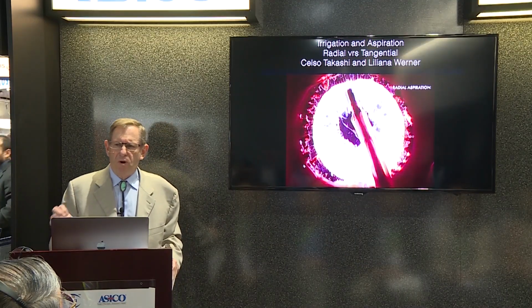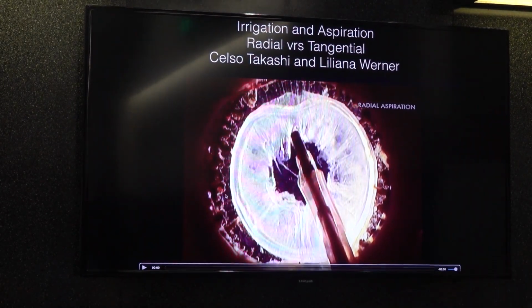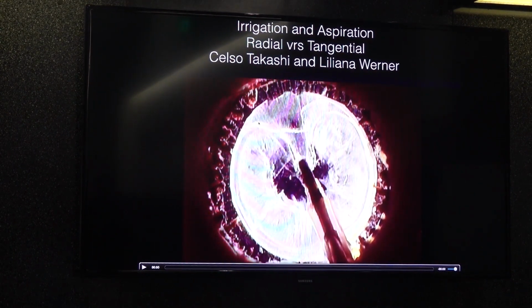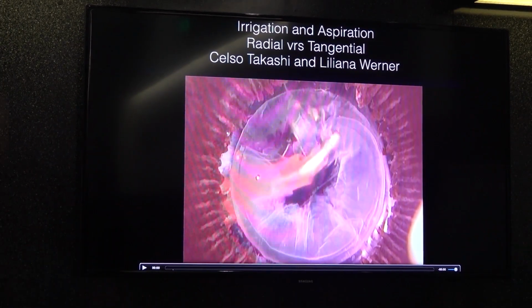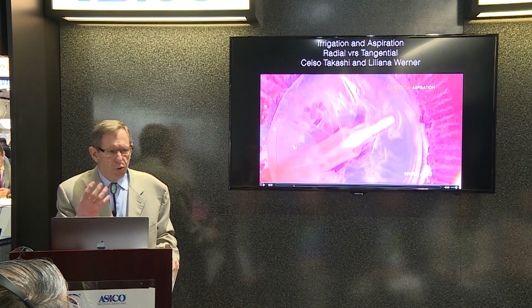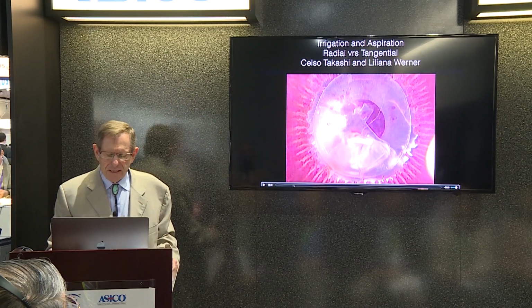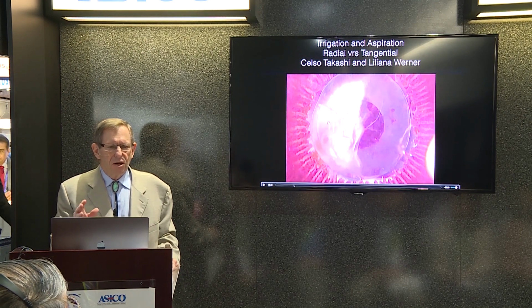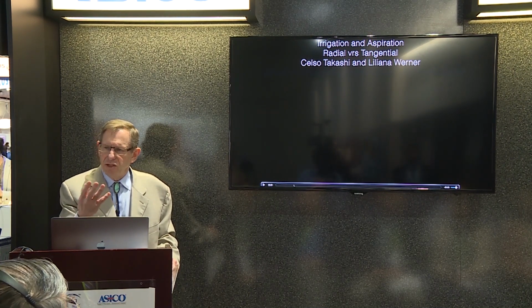When I was taught early on, what were we taught about stripping cortex? We would go under the capsule, grab a piece of cortex, and bring it to the center. But when you really analyze what's happening, look up here. I'm going to go back to that one little setting. If you look at the top of that, you'll realize that we're stretching the zonules as we're making that maneuver. We're pulling the zonules. So we were incorrectly teaching people to go to the center. And if you look at the tangential effect, very, very safe on zonules. But if you go to the OR and you look, almost everybody continues to do radial. They strip to the center.